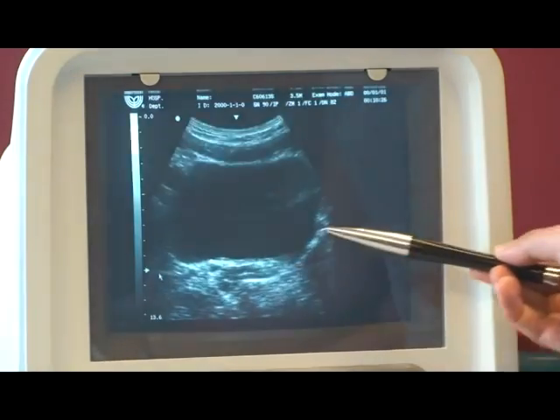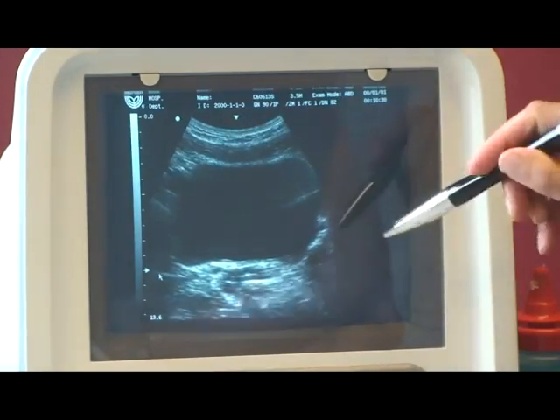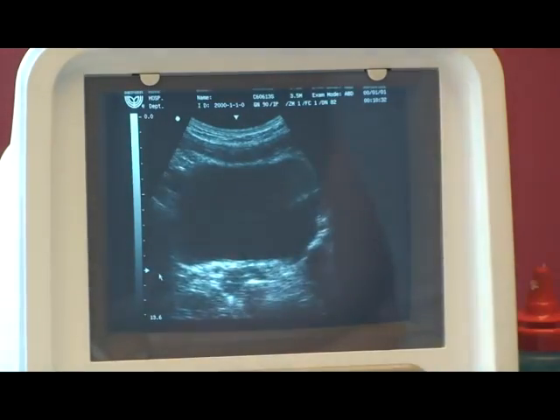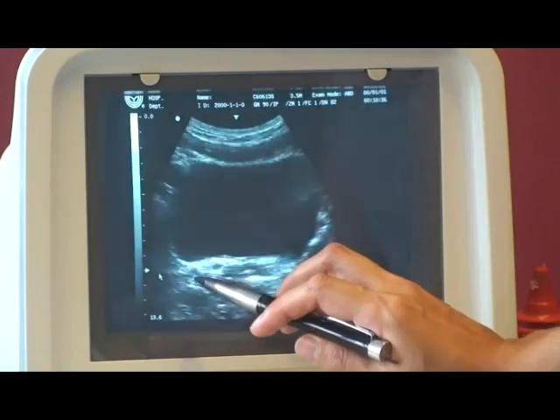This square here is the bladder, and that's quite a full bladder. If the bladder is slightly empty, it's more bow-shaped, like a bow tie. And this is the pelvic floor muscle at the base here.